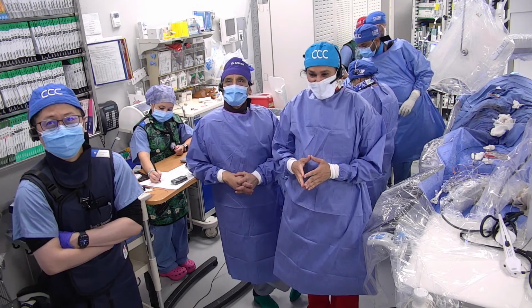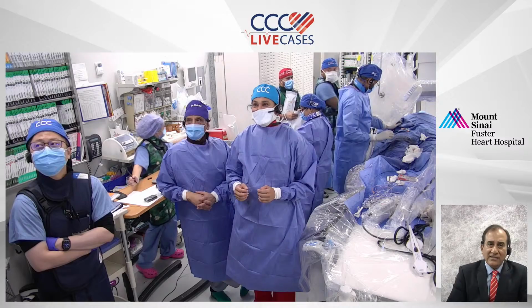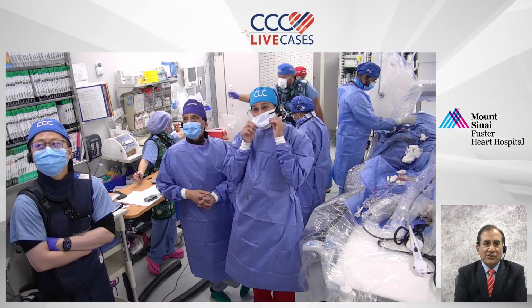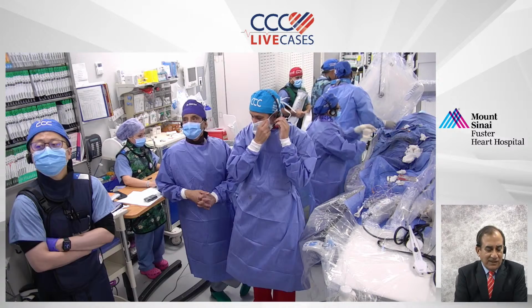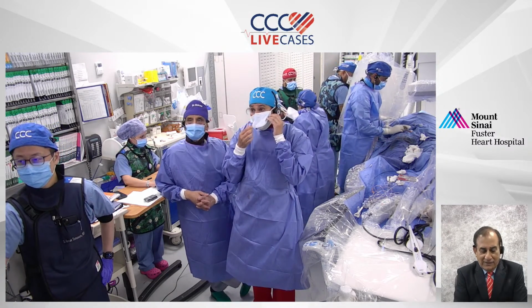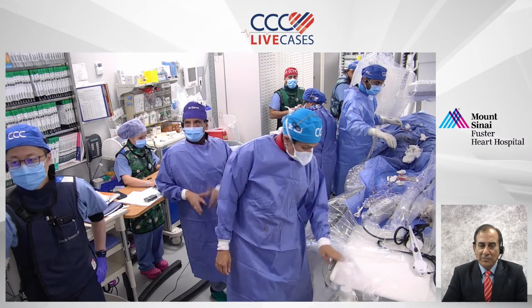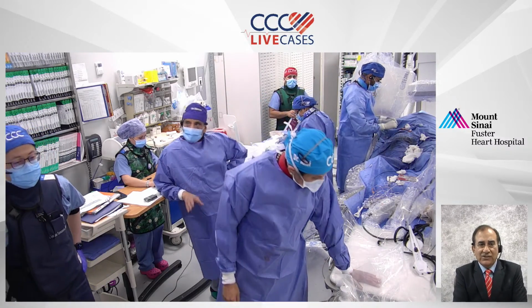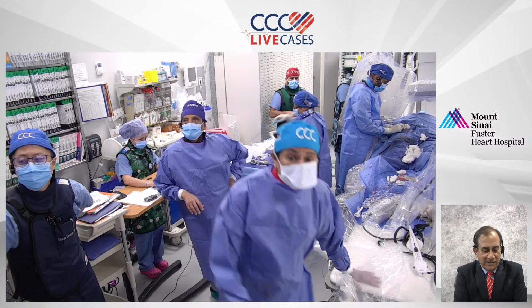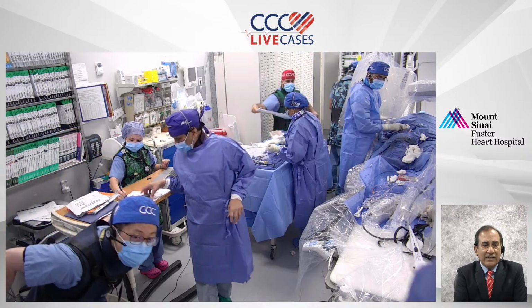Just to let you both know, the last 5 consecutive questions in the last 60 seconds have been about this particular point: should you leave the distal edge alone? So I'm glad you answered it. Dr. Kinney would completely leave it alone. Dr. Sharma may put a balloon there at extremely low pressure, but either way, the patient is doing fine. Excellent result. Samin, please proceed with your didactic.